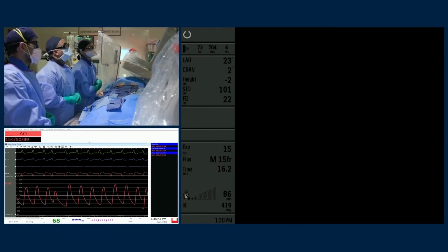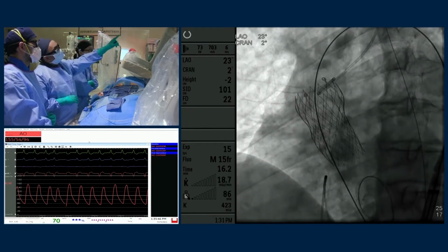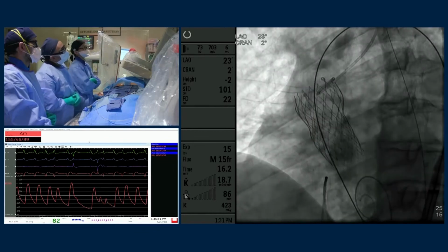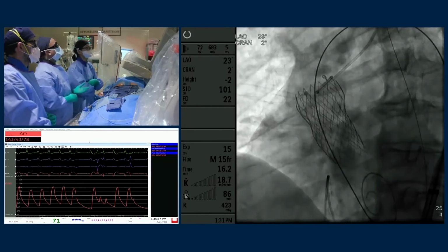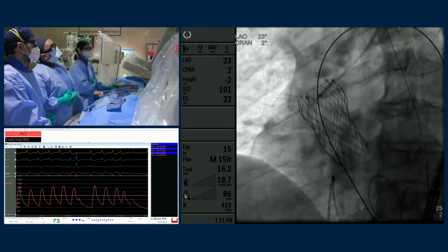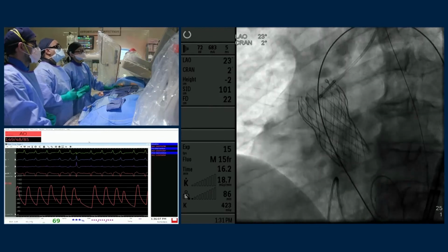Okay, great. Now look at the C mark, the head mark. The commissural tab, the C marker. You can actually see a C. Okay. What's it called? C tab? C tab. You can see a C, which would suggest that we're far away from the left main, and that there's no commissure in front of the left main. So I think we achieved the two things we wanted to do here.